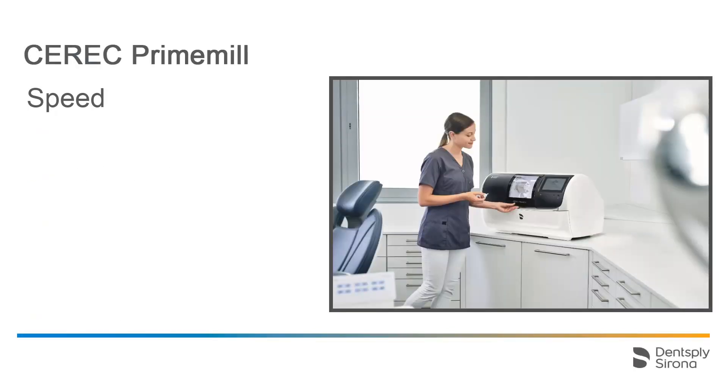The new option of equipping the CEREC PrimeMill at any point in time, followed by pre-touching the block, will save your patients valuable time. The CEREC PrimeMill can be equipped with the instruments and the block both ahead of and during a patient appointment, no matter in which phase of the CEREC software you are. The pre-touching process is initiated immediately after the equipment, so that the CEREC PrimeMill is immediately ready for the manufacturing process.